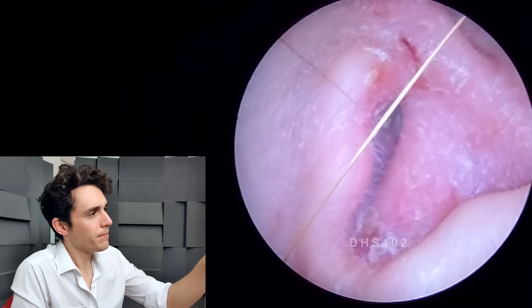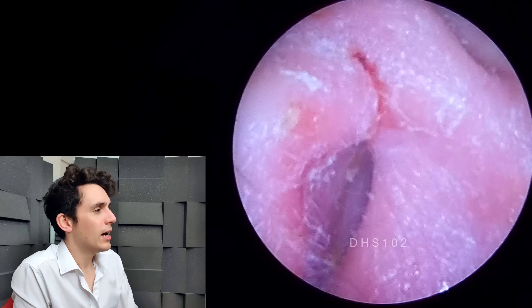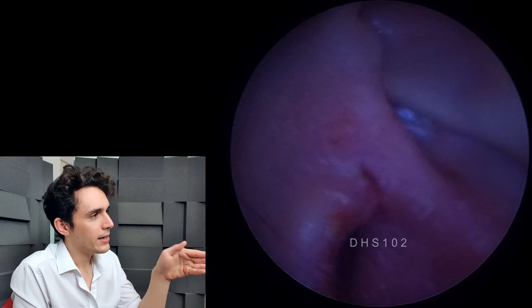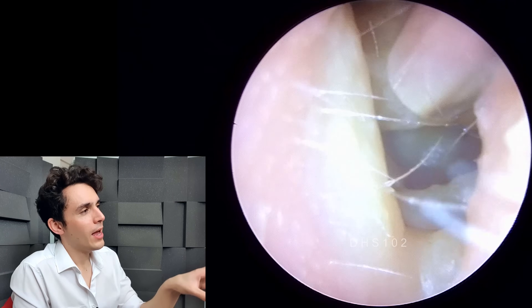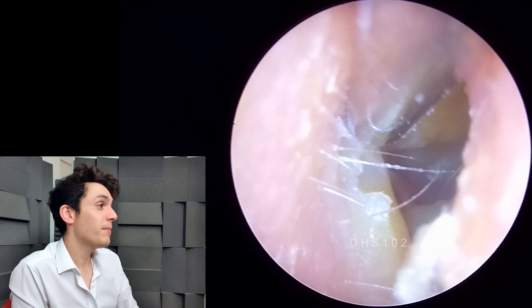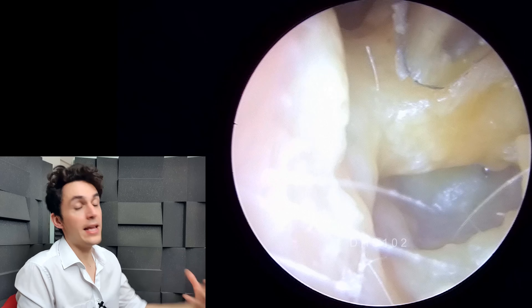This is the exterior, and as you can see there's redness, there's a fissure in the skin — so there's like a crack in the skin right there. Everything looks very sore. And then if we move inside the ear canal, you'll see that it's quite swollen. You may think that this is an ear filled with pus. I wouldn't say there's a huge amount of pus in there — it's basically what you would call a sluffy ear. There's a lot of wet, dead skin in there.